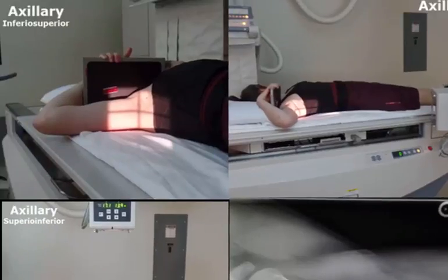Okay, let's look at a couple axillary projections that we can do. Here, we have the inferior-superior projection. When coming at an inferior approach, it's best to lay the patient flat on the table. You'll want to abduct the arm as far from the midline as possible. Typically, getting 15 to 30 degrees of abduction away from the midline is usually acceptable. The more range a patient can get, typically the better you can get axillary joint space on your image.